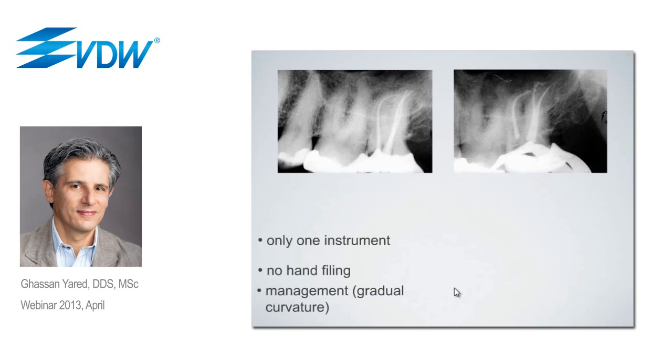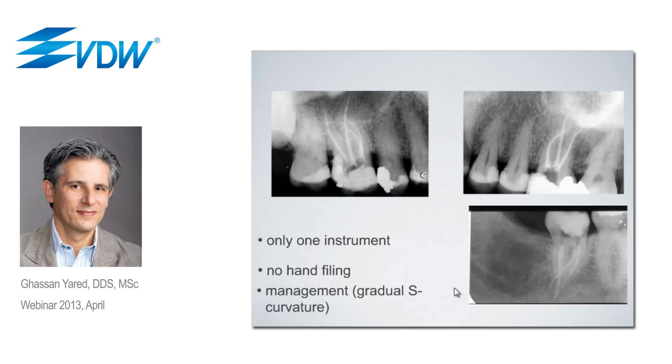And again here, I just want to put emphasis on the fact that the coronal enlargement is quite conservative. And again, this is a very important issue.